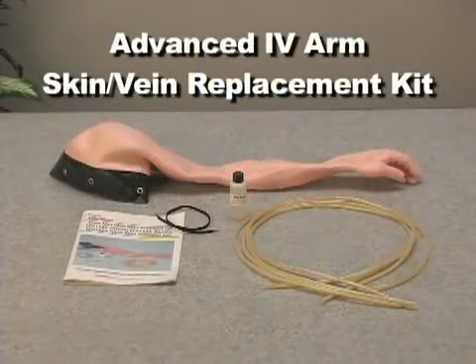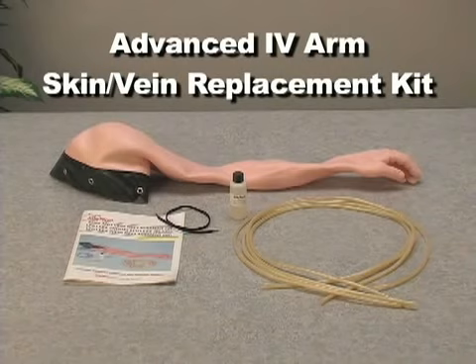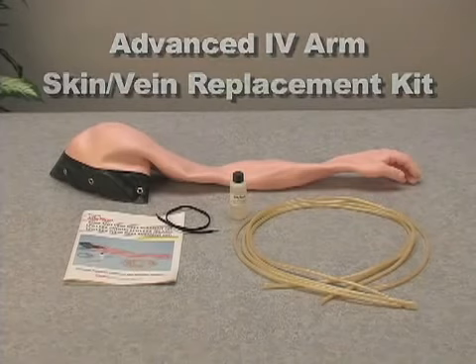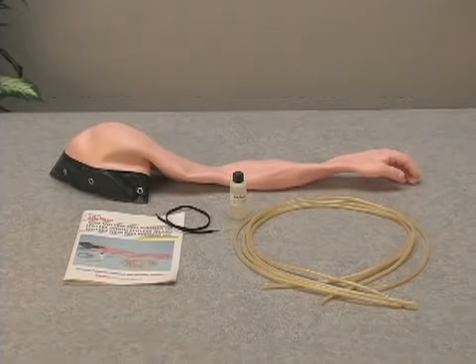Welcome to the instructional video for the Nasco Lifeform Advanced IV Arm Skin and Vein Replacement Kit. This video will enable you to easily change the skin and veins for our advanced venipuncture and injection arm by walking you through the process from start to finish.